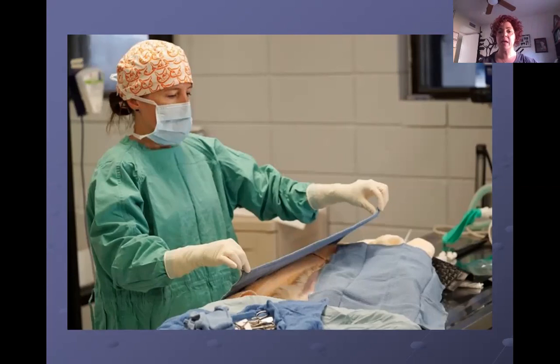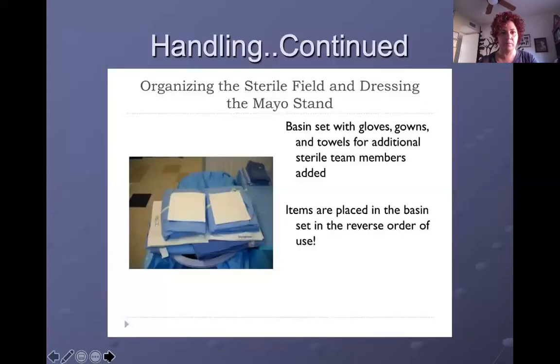It makes sense because we want to put that first towel closest to us so that it's establishing a little bit of a sterile field, right? Because we're going to be closest to that side. So we want to drape that side first. So not only will you get experience in the lab with preparing the square towels and passing the square towels, you'll also get experience with placing the sterile towels as well for squaring off. Questions or comments about any of that stuff?